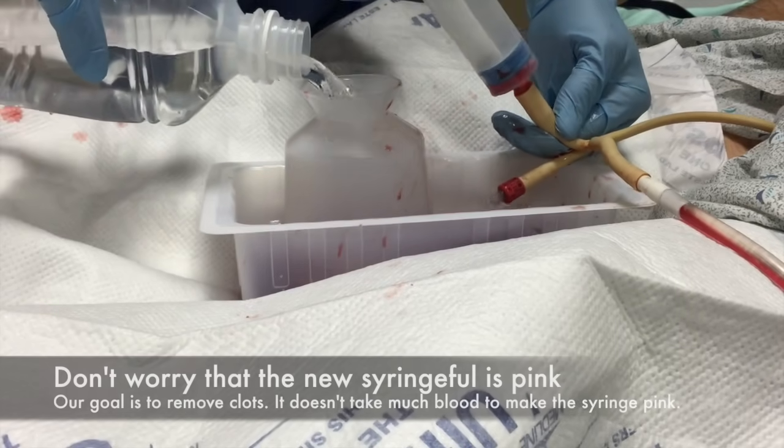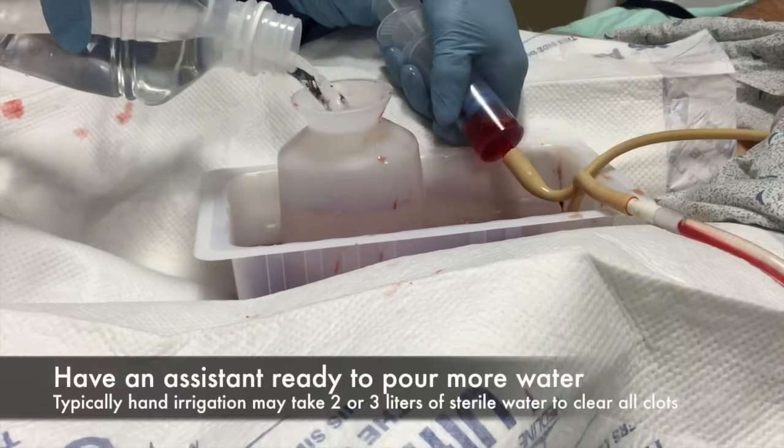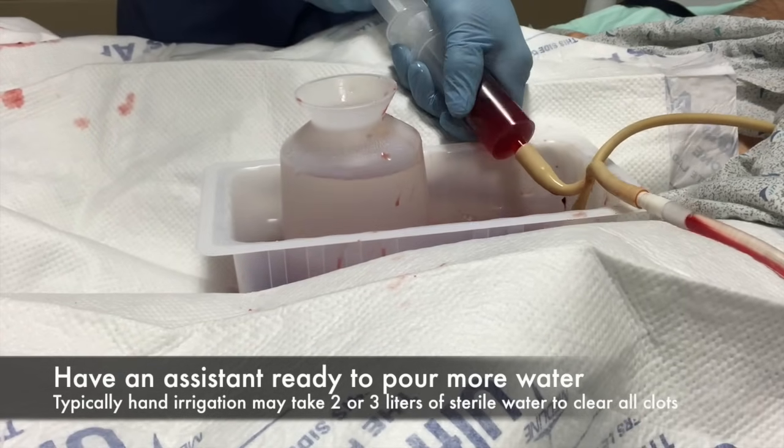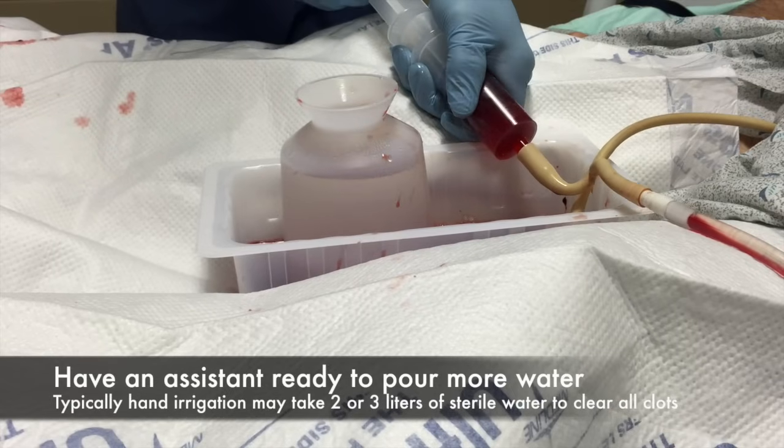We always make sure that we have an assistant nearby and have at least two or three liters of sterile water ready to go, as it's not uncommon to have to use that much in order to clear all the clots before hooking them up.